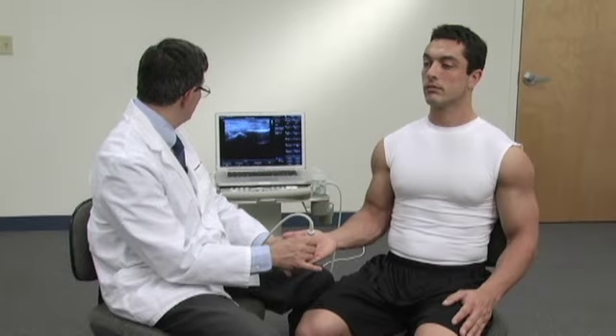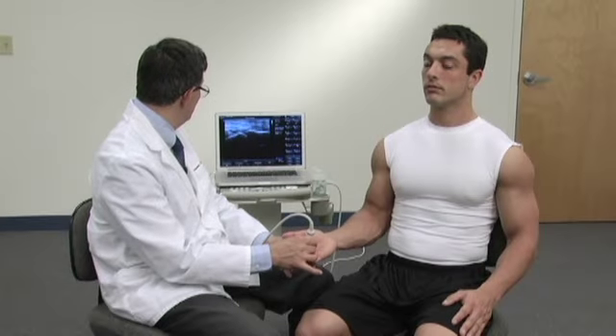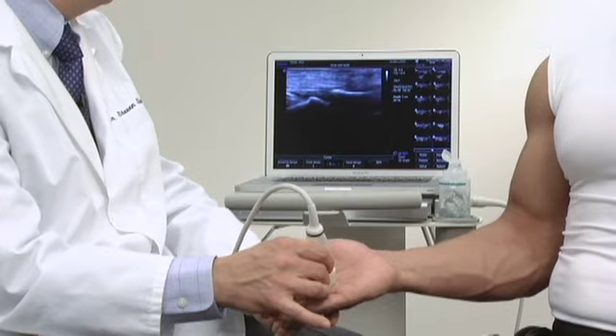Now I'm going to have you flex your finger so we can see the movement of the flexor tendon.